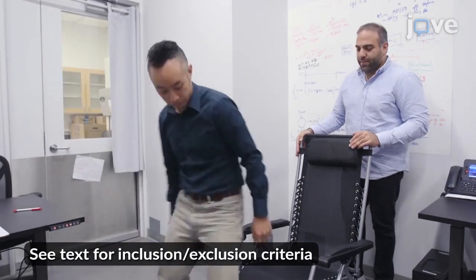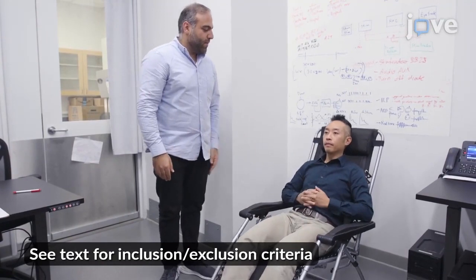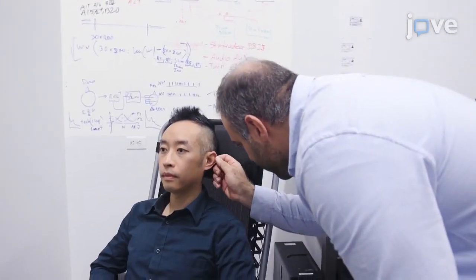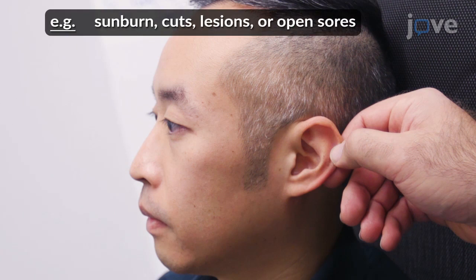Begin by seating the participant in a relaxed position with the legs elevated and the head supported. Inspect the left ear of the participant, confirming that no jewelry is attached, that all makeup and lotion are removed, and that there are no skin-related contraindications at the site of stimulation.